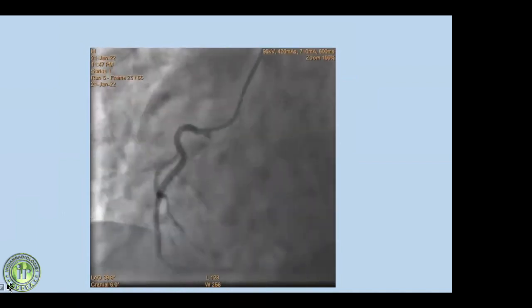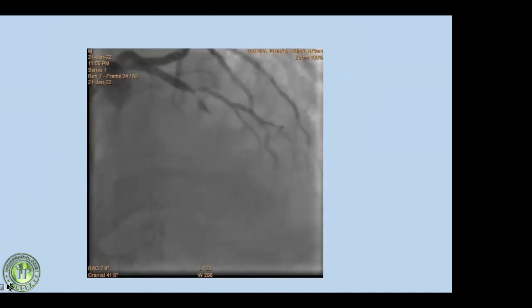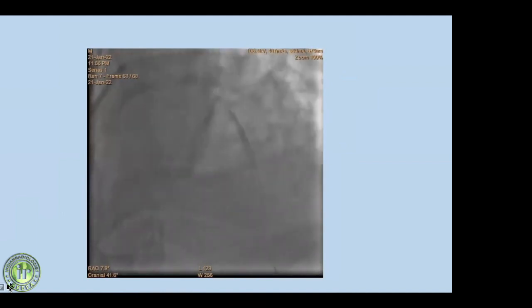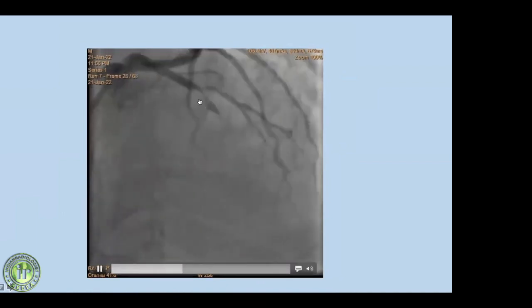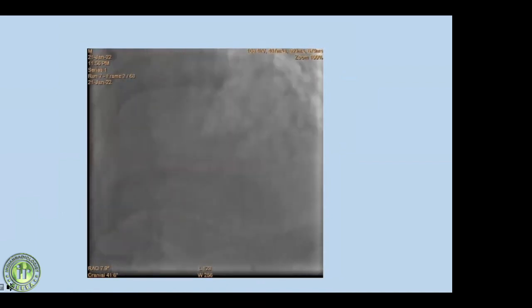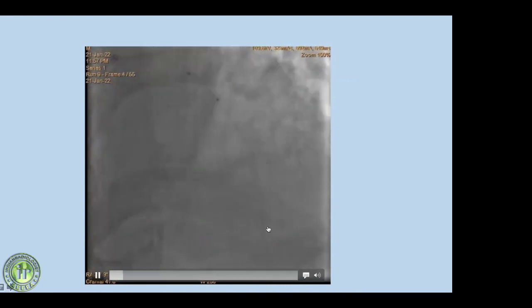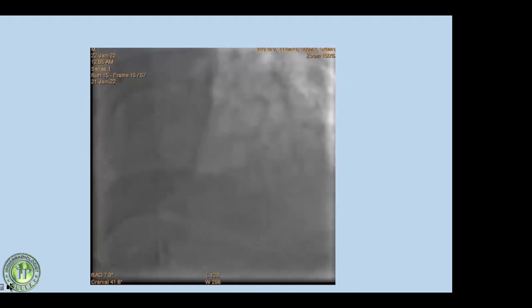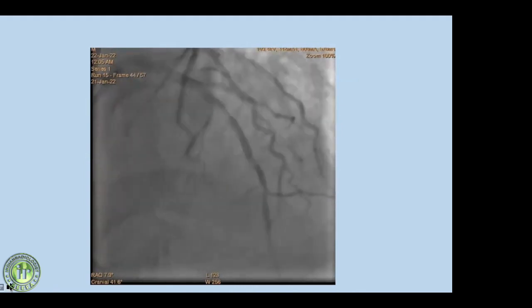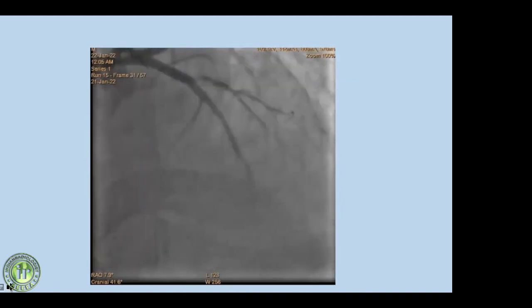The right coronary artery showed no significant narrowing. Since this was a short-segment tight stenosis, and the patient was within the 24-hour window, they proceeded with angioplasty and stenting. The guide wire was advanced, the balloon inflated, and a coronary stent was placed — a good result that the interventional cardiologist would be very happy with. Post-stenting follow-up showed good filling of all distal vessels.